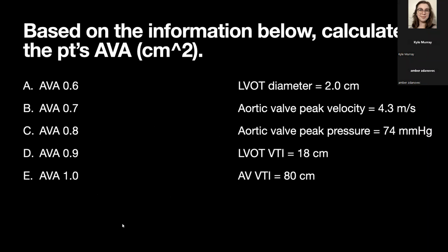All right. This is great because I know everybody has a phone. Based on the information below, calculate the patient's aortic valve area. And I think I have a couple of these because obviously repetition is beneficial.